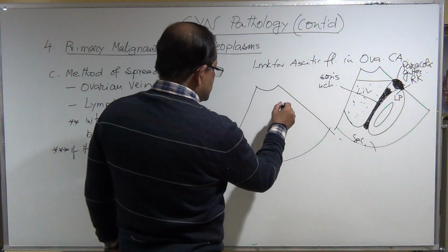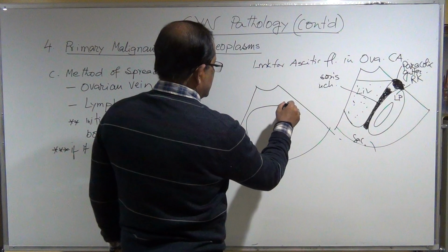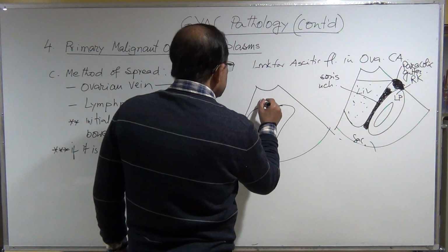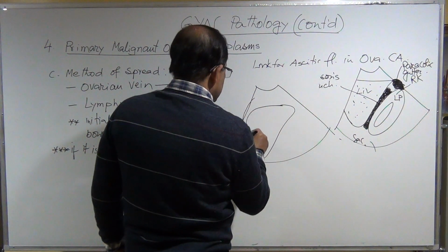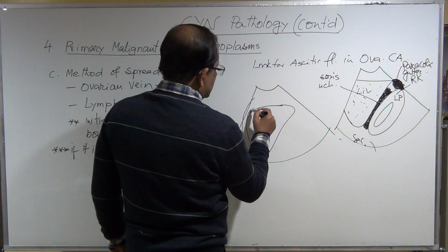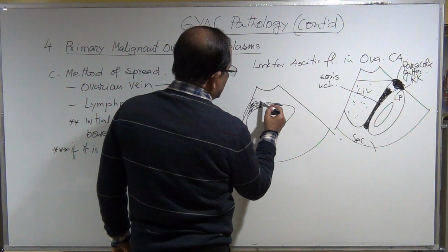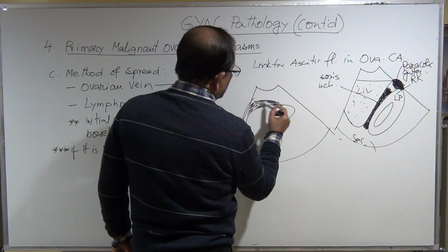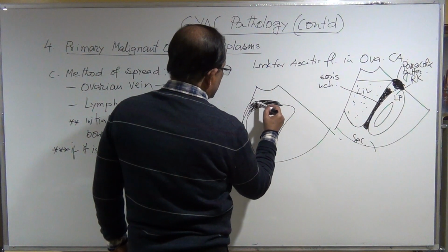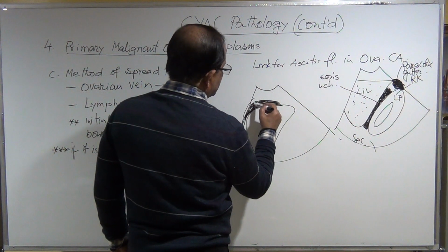Okay, if you see the liver, and you will see this is the diaphragm. Okay, and this is fluid above the liver.